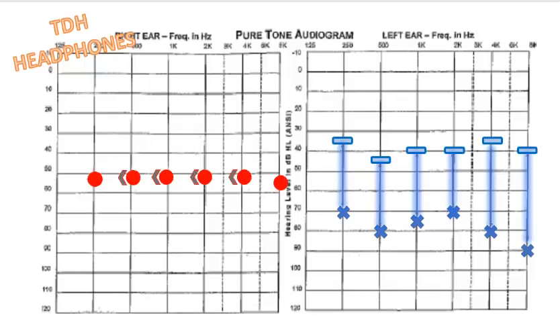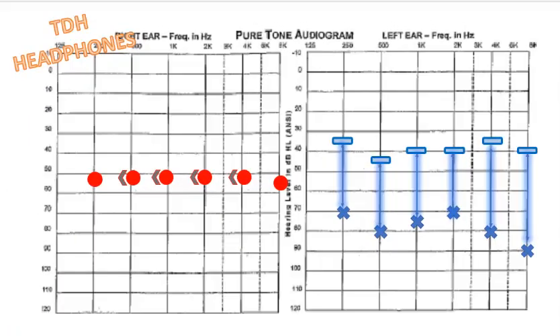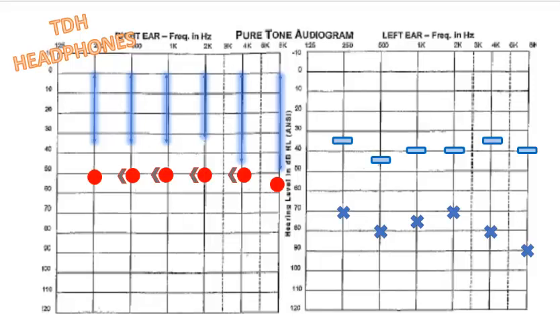a lot of crossover. We can estimate, however, what the maximum amount of crossover will be, or the maximum amount of potential crossover will be. We know that a certain amount of sound will definitely be attenuated via our min IA values. The most that can cross is highlighted by these glowing blue lines, which articulate the difference between the test level of each tone and the min IA value that we know is going to happen. When we transfer these maximum potential crossover values to the right ear, we see that the right ear would not be able to hear these cross signals.